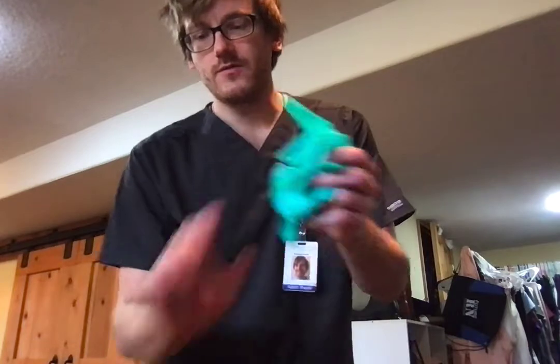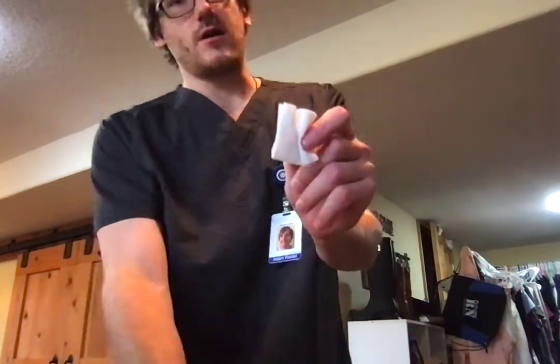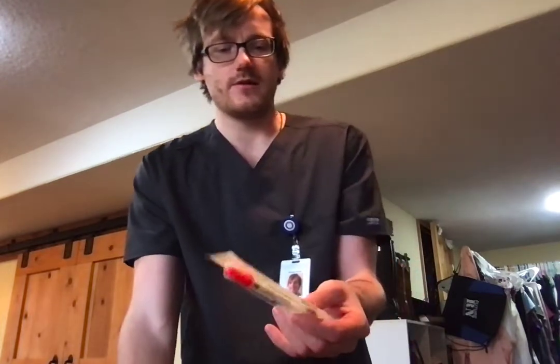This is my 225 intradermal administration medication video remediation. For this, I need a few things: some gloves, my pretend pad patient, some cotton swabs, alcohol swabs, and my multi-dose vial, and then my syringe, which is a milliliter, 25 gauge, 5/8 inch needle. So the order is 0.1 mLs of tuberculin for this patient.